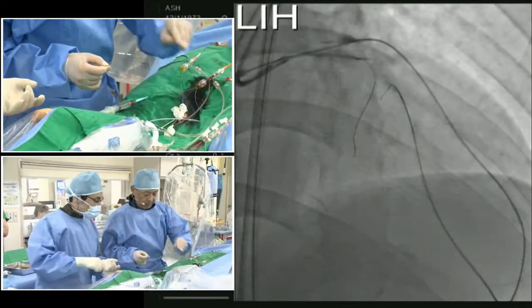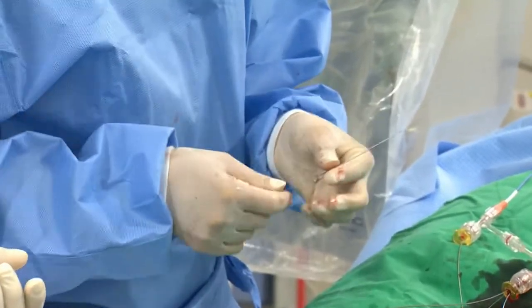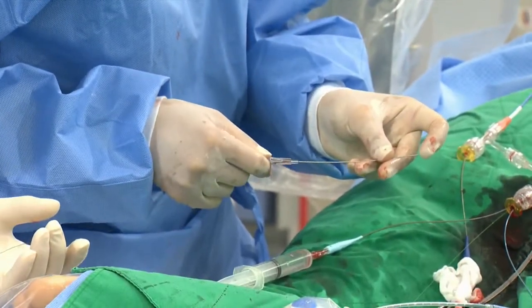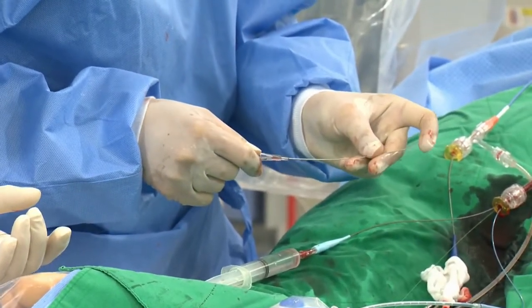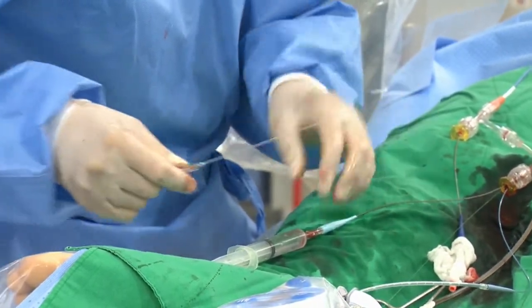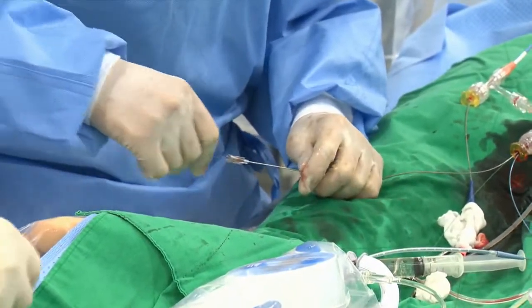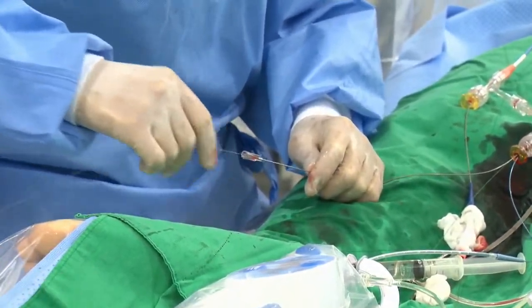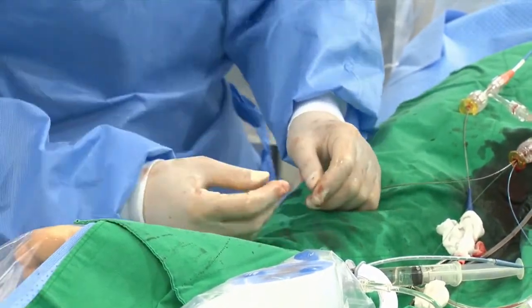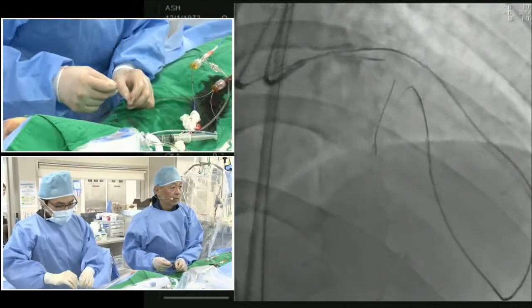Okay, there it is. And please stand by. Gaia. Is Gaia Next available? No? Is Next available? Yes? Okay. No, not available. Okay, so original Gaia Second. Okay, Gaia Second, please stand by. Please don't open. Only stand by.